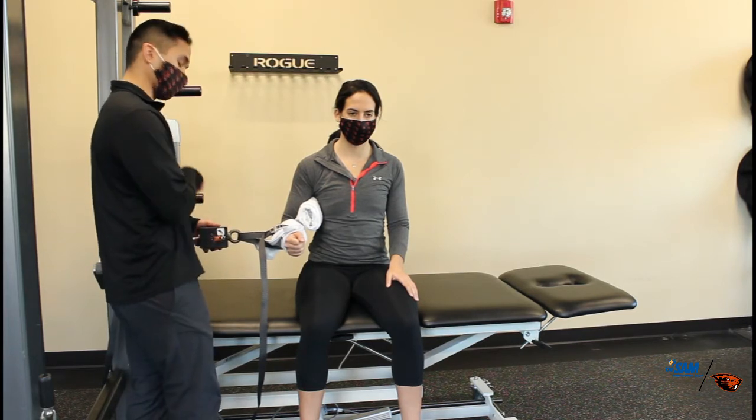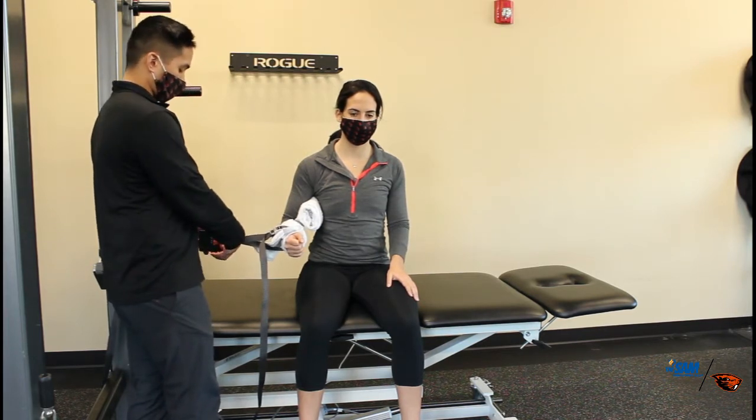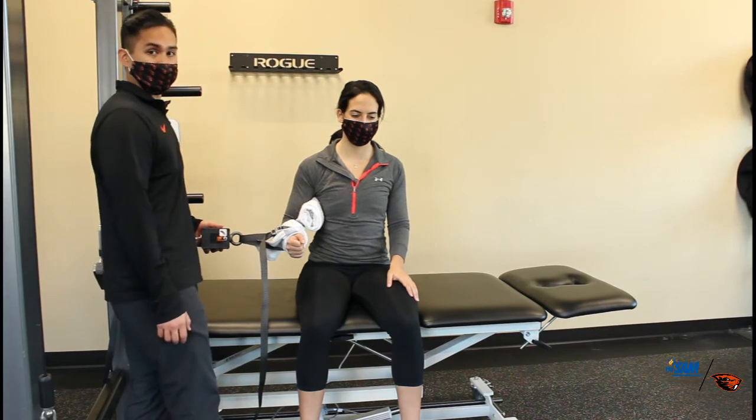Just a nuance of this device in particular — I'm going to turn it off, turn it on again, and then we're going to take the next rep.